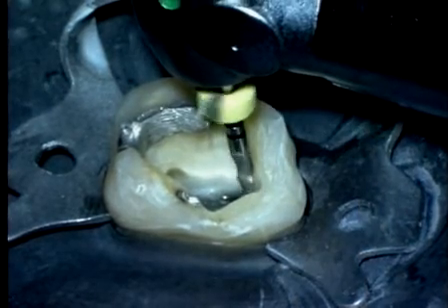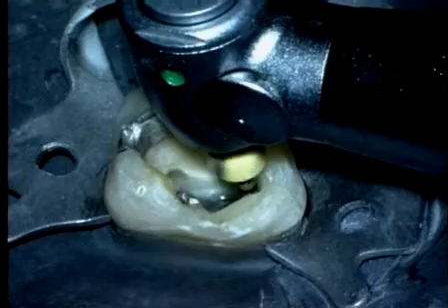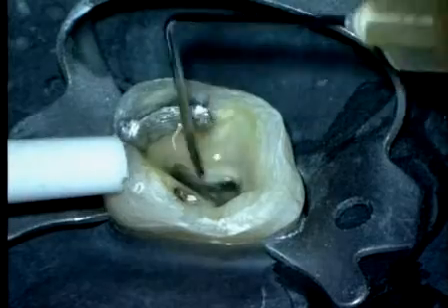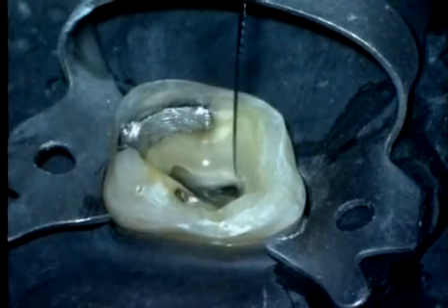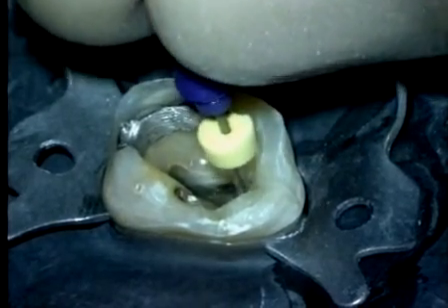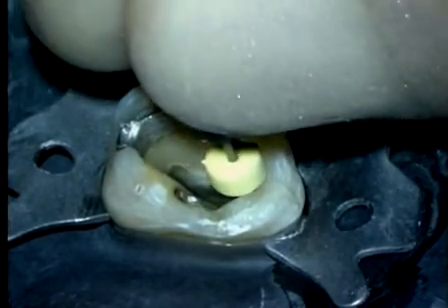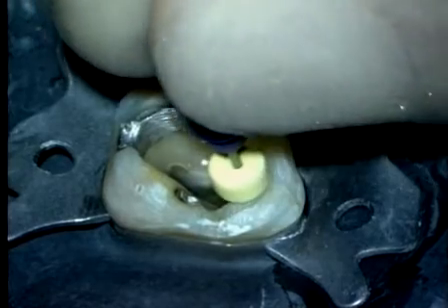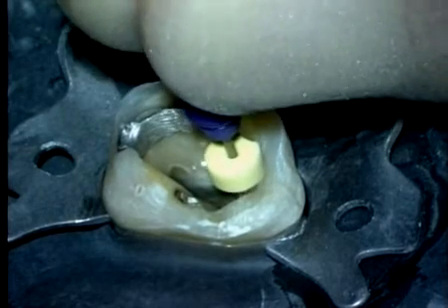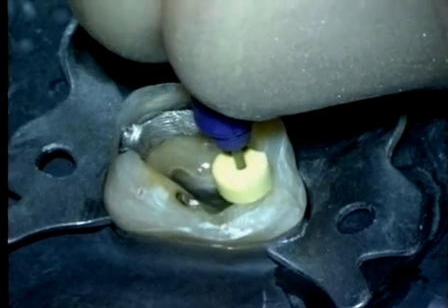Let the instrument float into the canal. I like to use the pencil lead analogy. Push no harder than you are writing with a pencil without breaking the lead. When we've achieved the level of where Shaper 1 went, the instrument is immediately withdrawn. Irrigate and recapitulate and re-irrigate. The 10 file is easily passed through the pre-enlarged canal. A pre-enlarged canal will generally allow the 10 file to slide to length. Once we're at length, stay at length, and carefully and repeatedly explore and refine the glide path. When we have a smooth and reproducible glide path, patency is established.